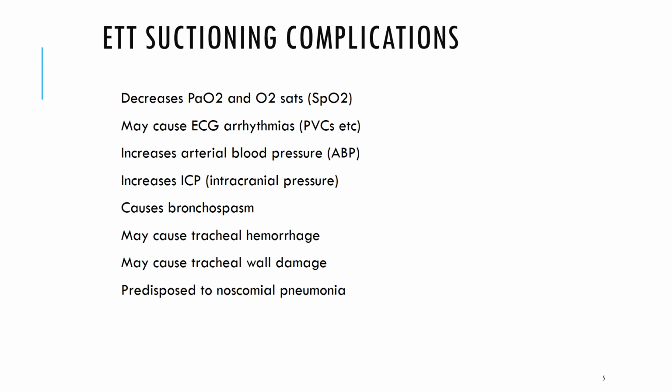So therefore, it's really common, and sometimes even in the hospital protocol, to hyperoxygenate a patient before suctioning. And all this involves is turning up the FiO2 setting up to 100% temporarily before suctioning, and then letting the FiO2 setting go back down to the previous setting afterward.